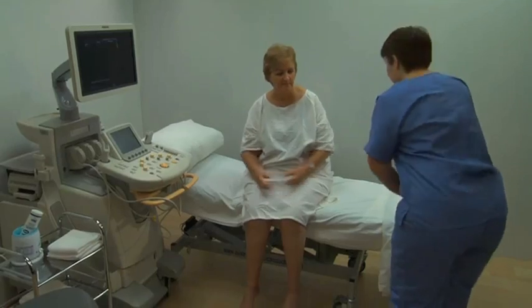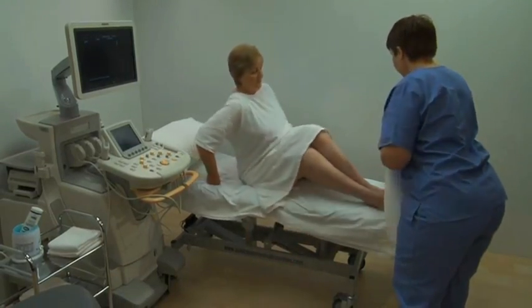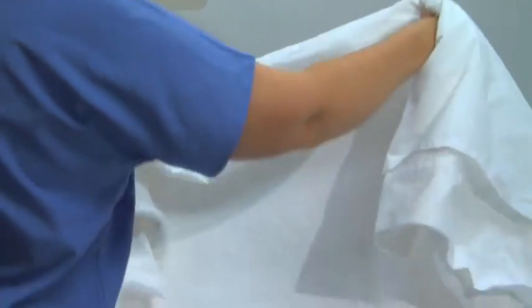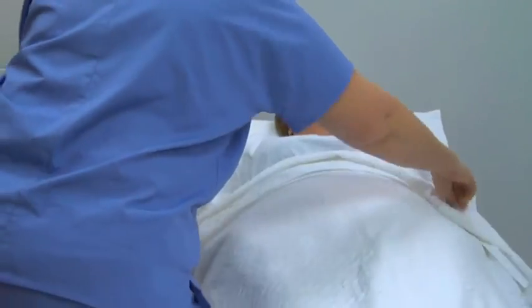Explain the technique of breath holding and, if necessary, the Valsalva maneuver. Ask the patient to lie supine on the bed and make them comfortable with the use of pillows or wedges positioned as required.